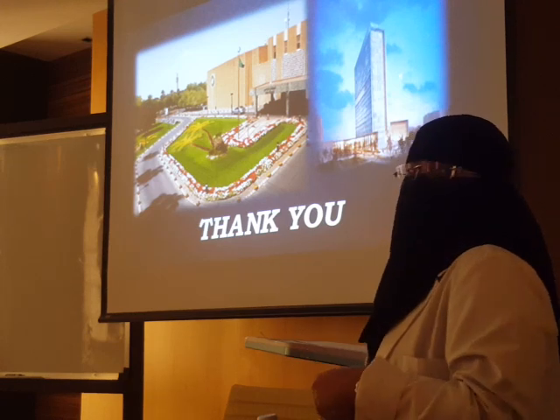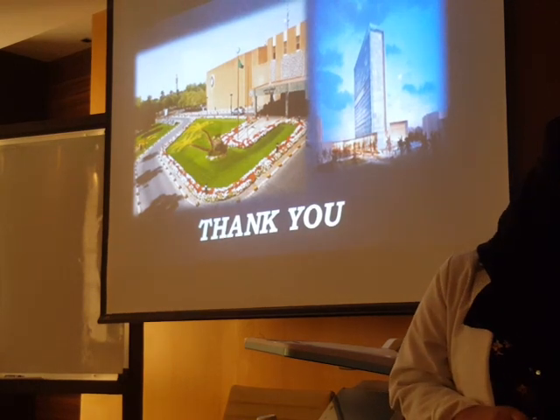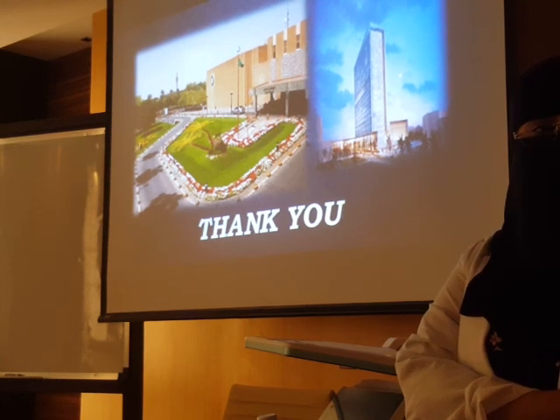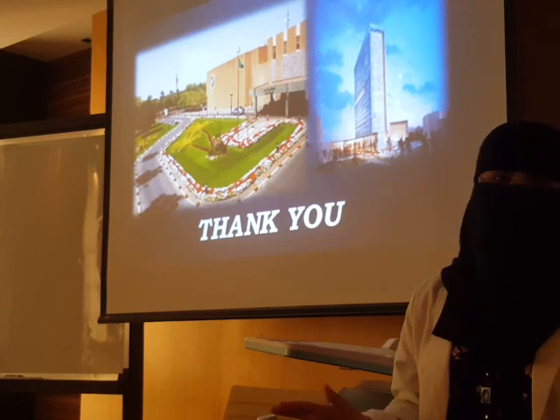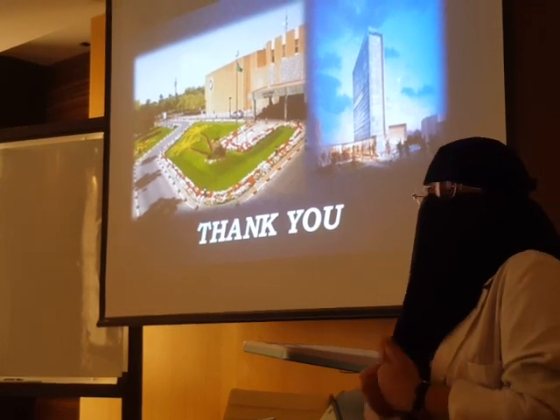بالنسبة للتكنيك أو البوزيشن حق الطفل في الكرونيك في كونجنتال بايلوريك ستينوزس، أحيانا بنعمل فحص والأم وهي شايلاه، أحيانا هو سوباين. أحيانا الأفضل إيه؟ لأن, you know, ultrasound is challenging, especially with the pediatric, because عاوزين خبرتك بقى في الحالات دي. You are the one who is getting the information.